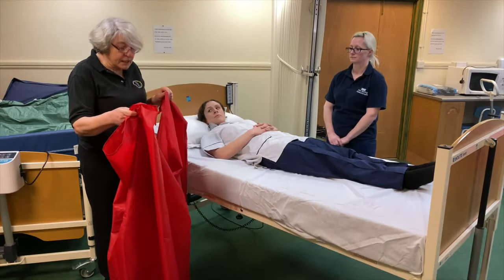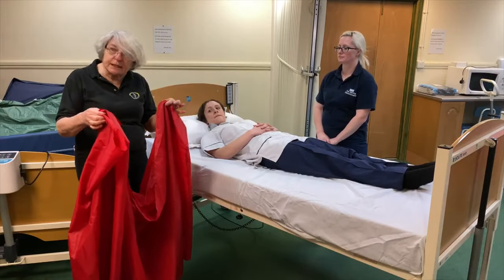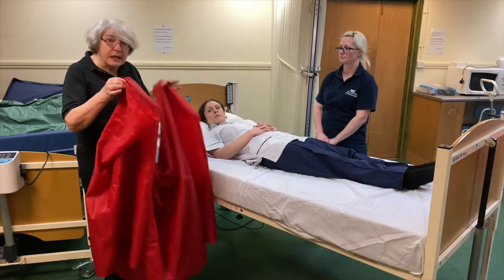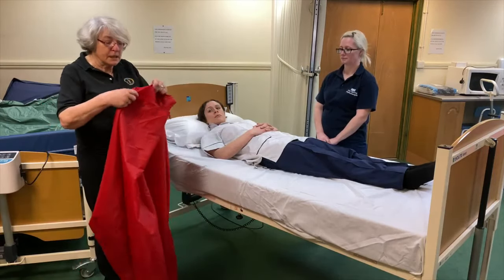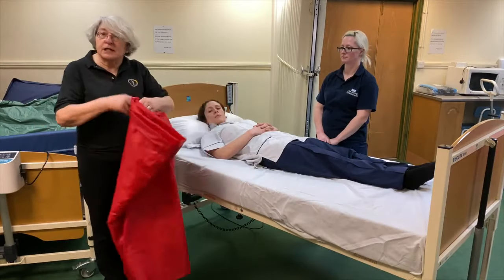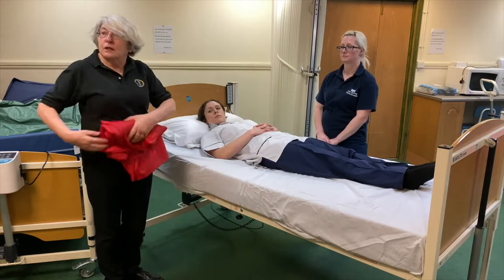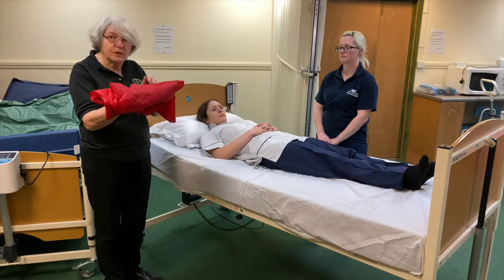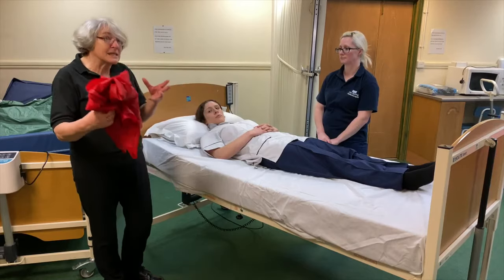The only other thing I'm going to say about slide sheets, that if this should drop to the floor, pick it up immediately. It's not just about infection control, but it's about if you should accidentally put your foot on it and slip, there could actually be an accident. These should be kept folded, ideally in a plastic bag, in the locker. And most of the hospitals have got, I'm looking at Priya, because I think your hospital had a shelf that they would go into. A hook in the cupboard. It's in the person's cupboard, but you have to be careful that when the door opens, it hasn't fallen. So ideally, folded on a shelf on their own, in a plastic bag.